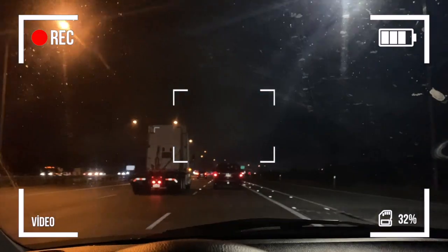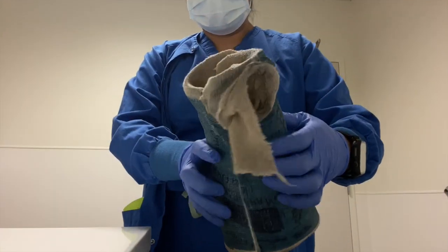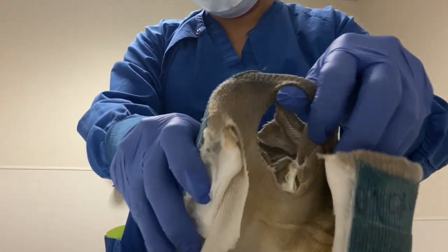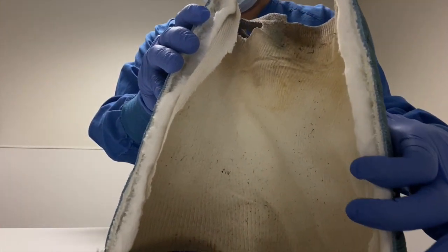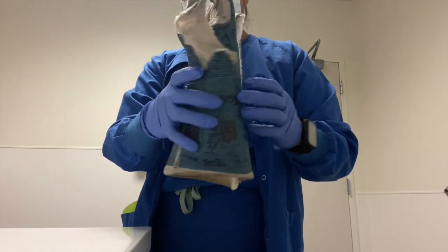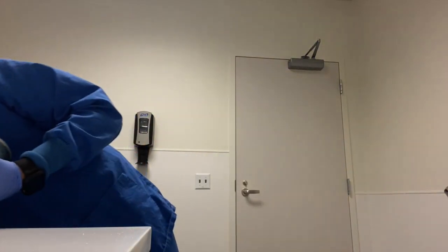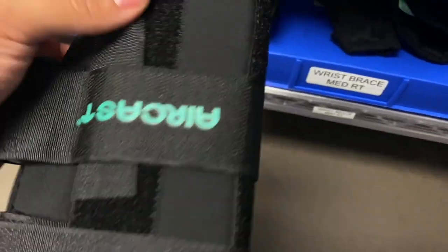We are heading to work and I'm thankful I'm not going to Seattle because it is just crazy with traffic. Our first cast removal of the morning is this short arm cast. As you can see in the video, some of the fiberglass was removed by the patient. This is a good reminder for myself to add another layer of fiberglass, because sometimes kids pick on their cast — and I don't really blame them because having a cast is really uncomfortable. Since the patient was not going back into a cast, we gave him a wrist brace to wear with activities.